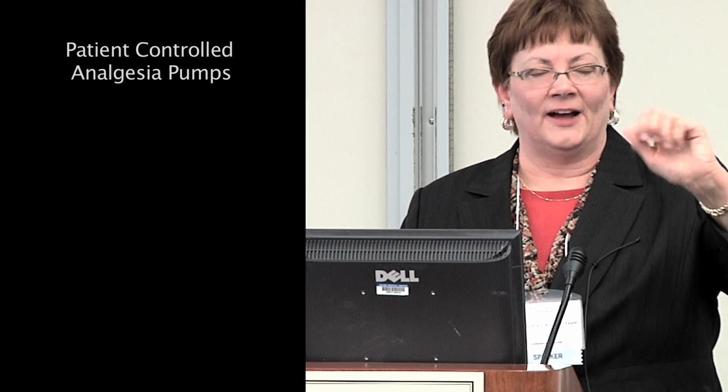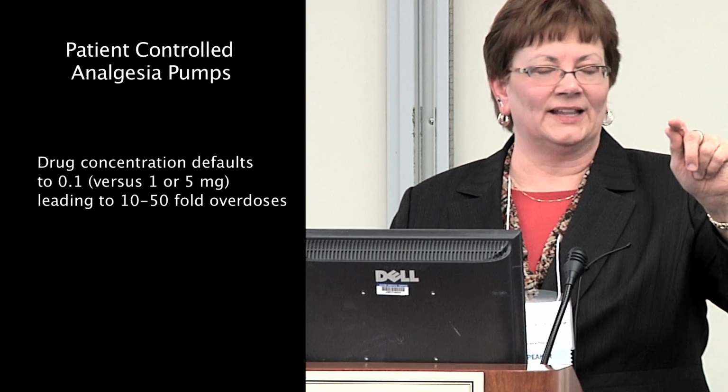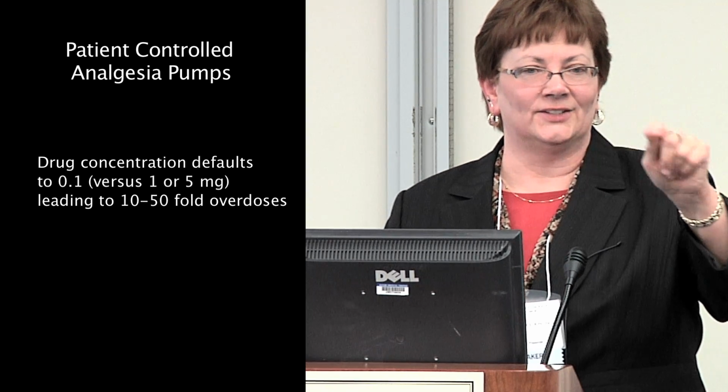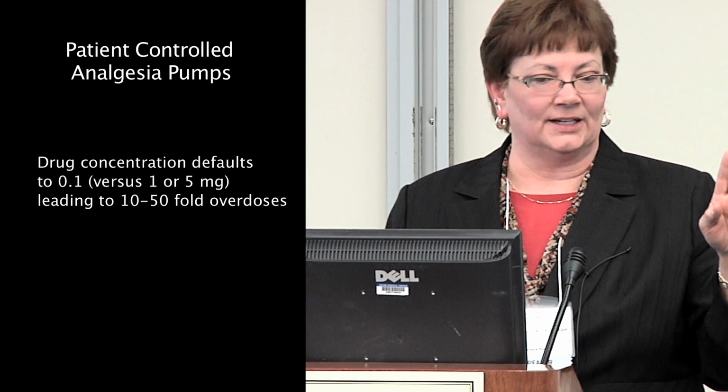But the Abbott, so while they're programming the morphine, the nurse is standing there with the pump going, and I'm like, what's the matter? She goes, well, I can't get the machine to start. Well, it's this exact thing. There's 2 problems with that pump. Hopefully most of them are out of service now. The one is you turn the machine on, it defaults to 0.1. If I have 5 milligrams, that's a 50-fold overdose because the concentration is 5.0, not 0.1. If I have a 1 milligram morphine, it's a 10-fold overdose. So there's lots of injuries from that.